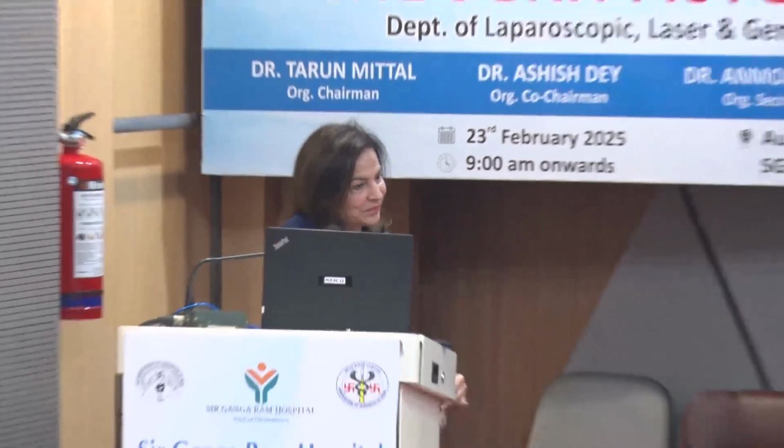Ma'am, just one last thing. A couple of wish lists that I have for radiologists. The main problem in fistula surgery, the biggest question for me, is how much of the external sphincter is involved. And that is rarely there in the MRI report. I agree. I wish you could tell us what percentage of the sphincter lies below the point where the tract is piercing the sphincter, number one.